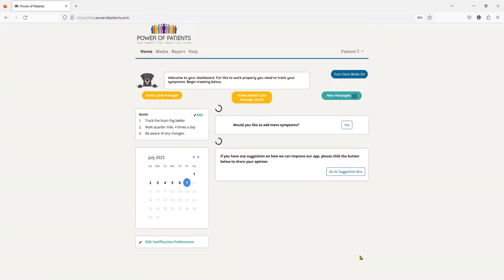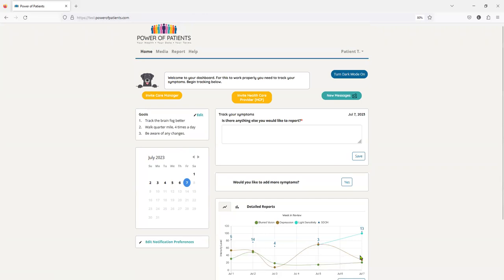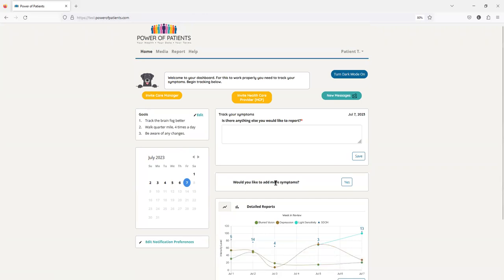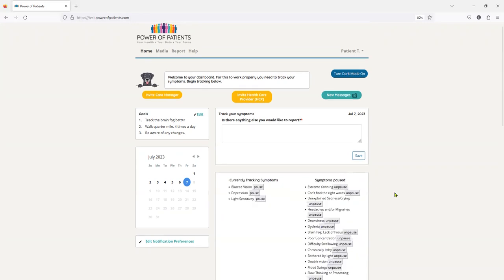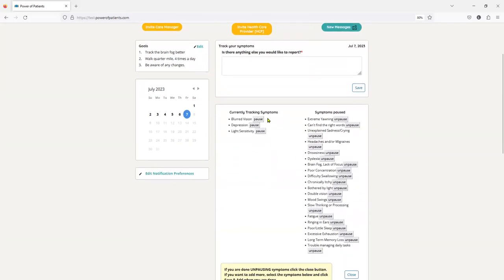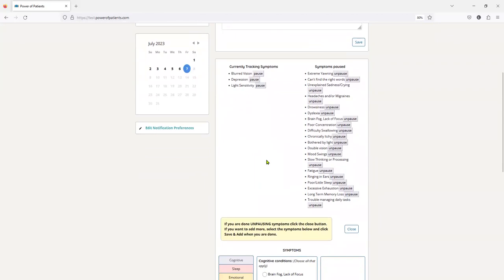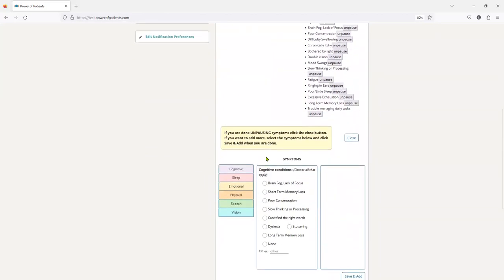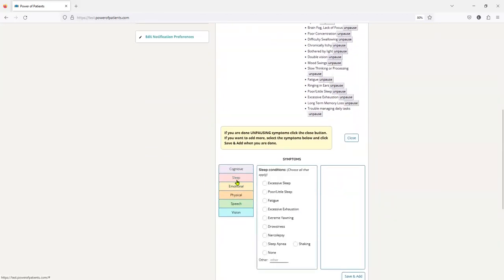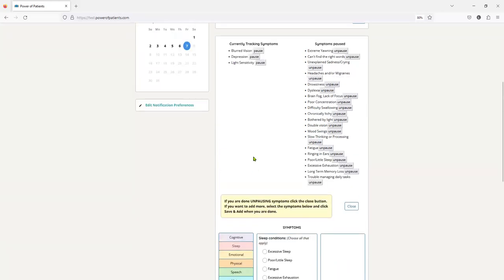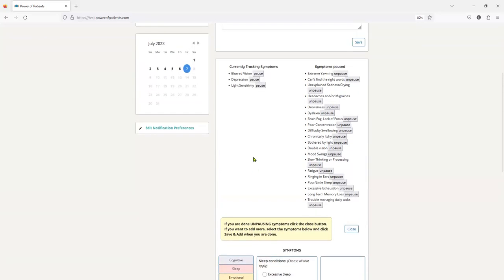So now I want to go back and just show you quickly how easy it is to add symptoms. Right here at this button, would you like to add some symptoms? Well yes, I would. So currently, you can see these are the symptoms that I'm tracking. These are the symptoms I was tracking. So I've obviously made a very big improvement. I can unpause these symptoms and bring them back in. I can pause them. And I can come down here, and I can start clicking on these other ones. And I can say, oh, I really kind of want to add this one.